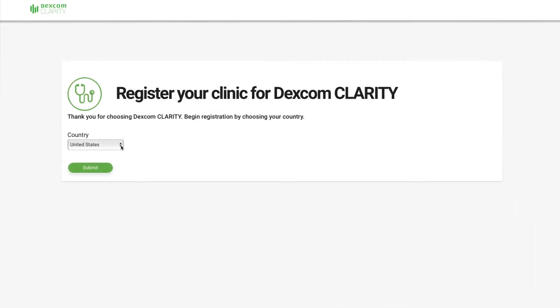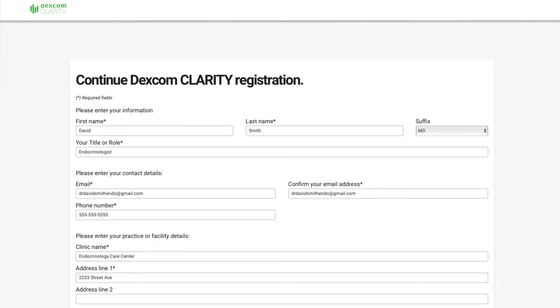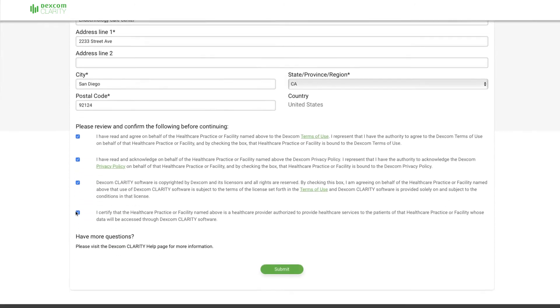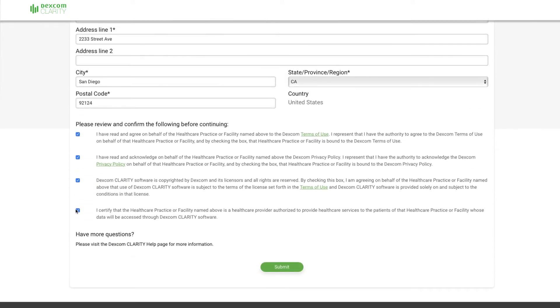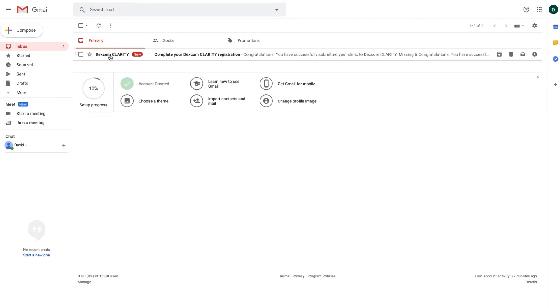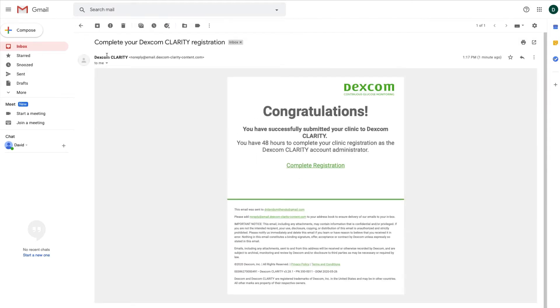Select your country and click Submit. Fill out the form, then click Submit. Now check your email inbox for the email from Dexcom to complete the registration. You will need to click the complete registration link in the email.